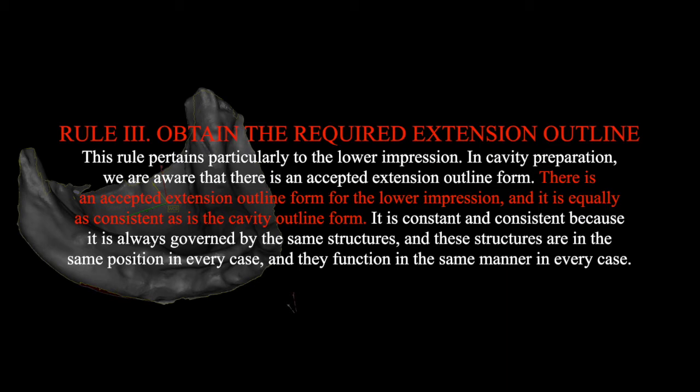There is also an acceptable extension outline form for the lower impression, and it is equally as consistent as a cavity outline form, meaning there are very specific outline forms that you need to look into. It is consistent because it's always governed by the same structures, and these structures are in the same position in every case, and they function in the same manner in every case.